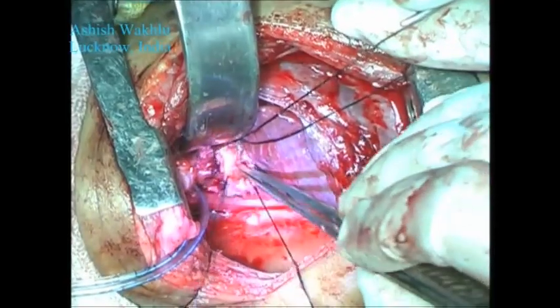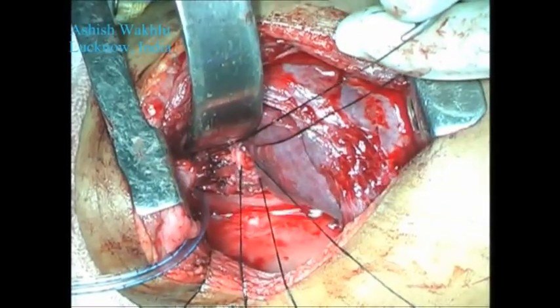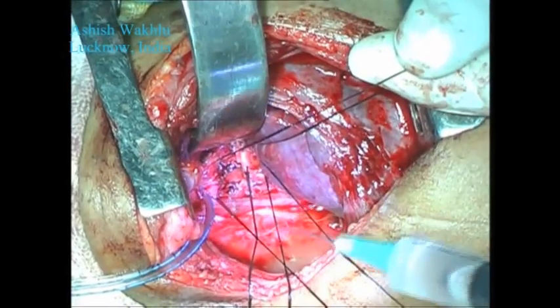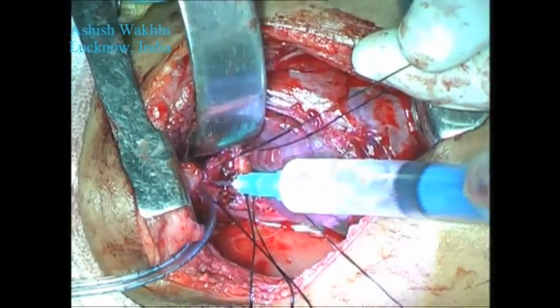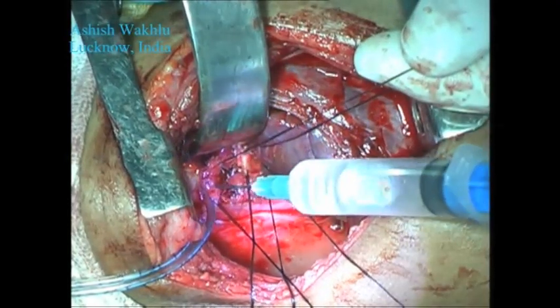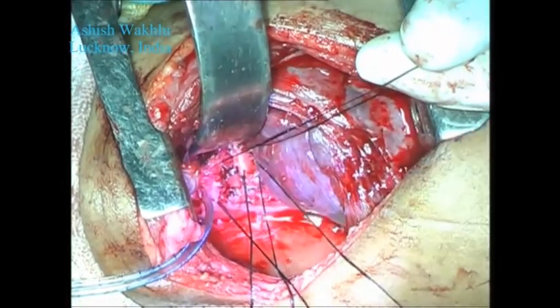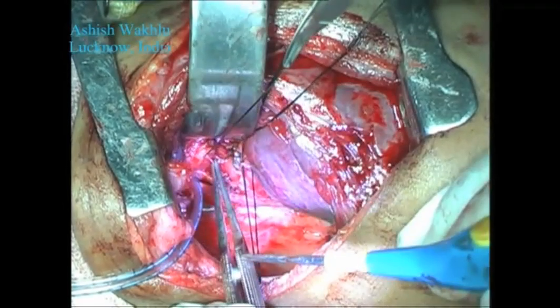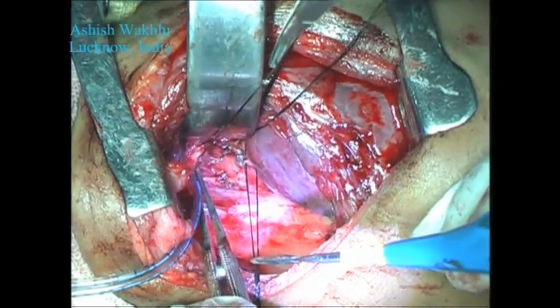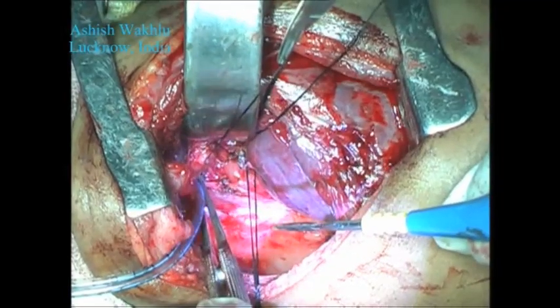We are just testing that the bronchial bifurcation can approach the stump of the right main bronchus comfortably without tension, and it seems to be doing that. Air is being aspirated into a saline filled syringe to confirm that this is indeed the stump of the right main bronchus, which will now be opened to join it to the lung hilum.